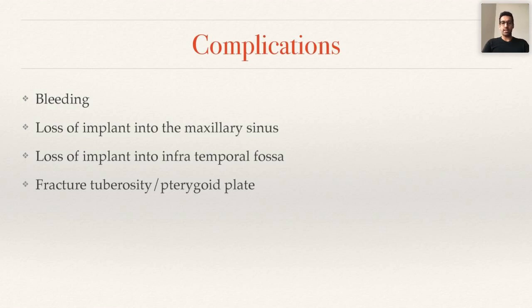Complications are documented in the literature. Many years ago, when people were experimenting, some of the surgeons who developed this technique used to place much longer implants into the pterygoid region, and they came across significant bleeds. That's because they were placing implants longer than 20 to 25 millimeters, and they were hitting crucial vessels in that region, and there are documented cases of bleeds. So if you stick to implants that are either 15 or maximum 18 millimeters, we should hopefully avoid that.